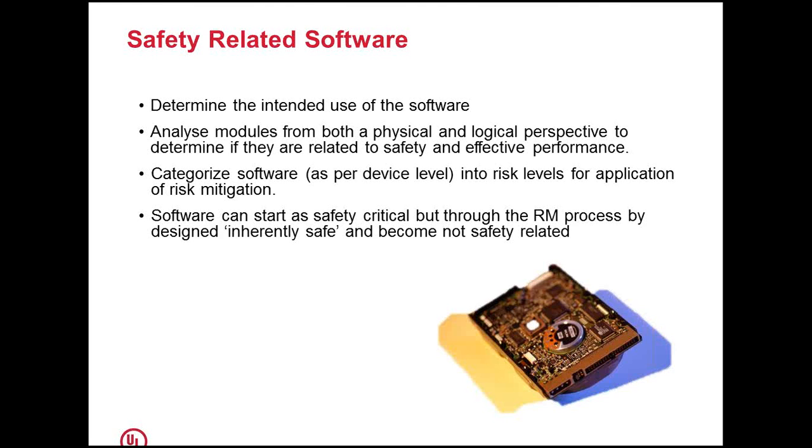So first thing, we need to identify whether the software is attributed to the safe and effective functioning of the medical device, or it is playing an important role in determining the diagnosis of an image. To do that, we need to first determine the intended use of the software. What is the role of the software in the whole medical device or in the healthcare delivery chain? That needs to be determined.